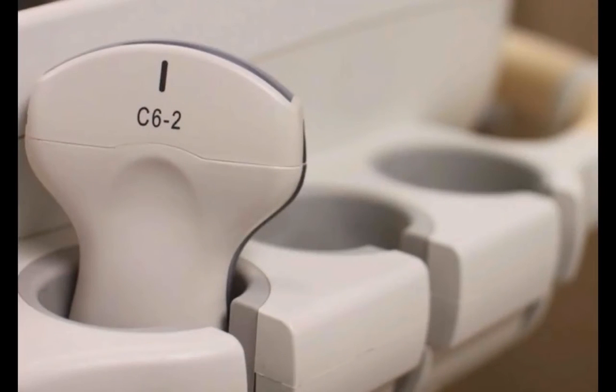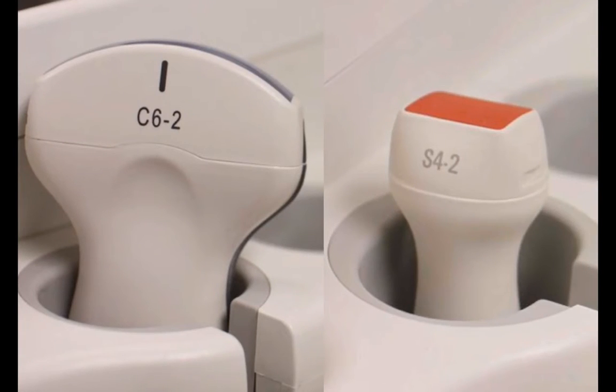All right. Teach me how to use this in my patients. All right, I can do that. Do you mind if we start with pulmonary edema first? This is your world. All right. So let's talk about the probe first. The curvilinear probe is going to be your best probe to do this. It's got a good combination of high frequency with good penetrance. Your phased array transducer will also work, but if you have to choose between the two, I definitely use the curvilinear probe first. Now, Matt, I want to show you what pulmonary edema does not look like.